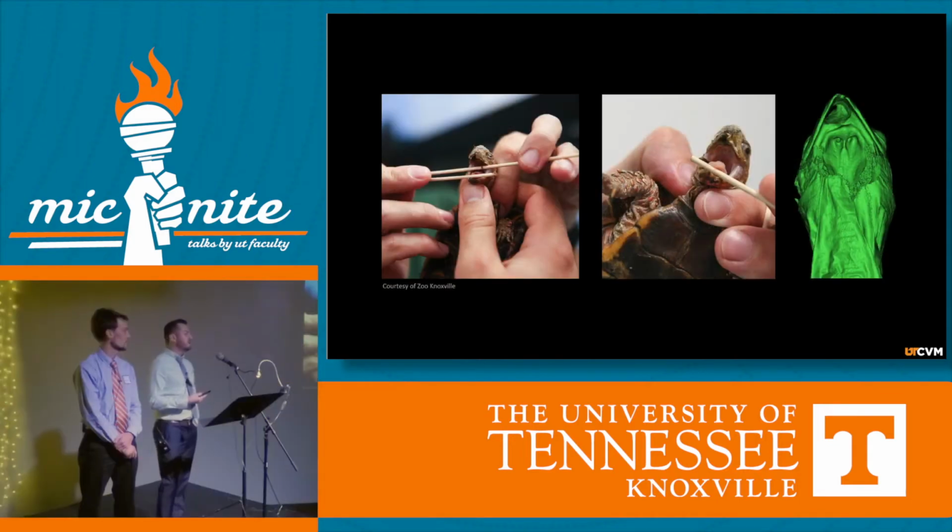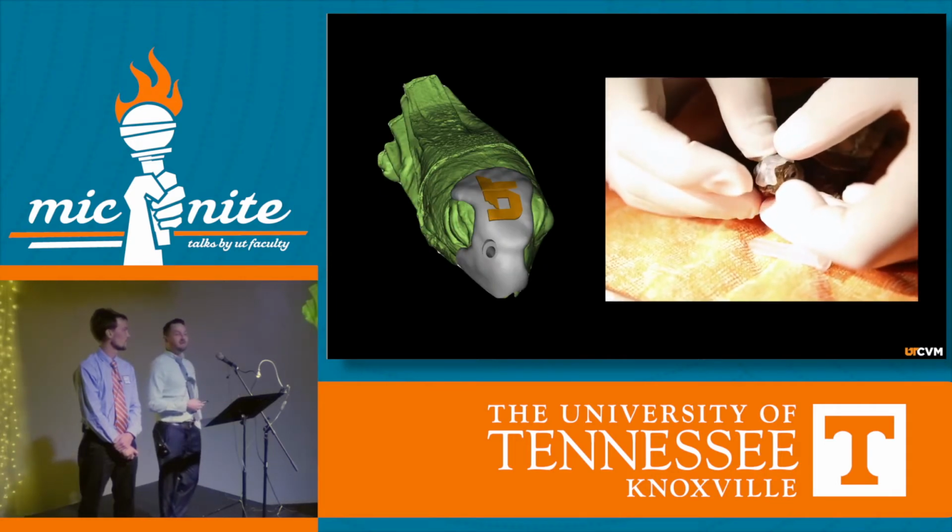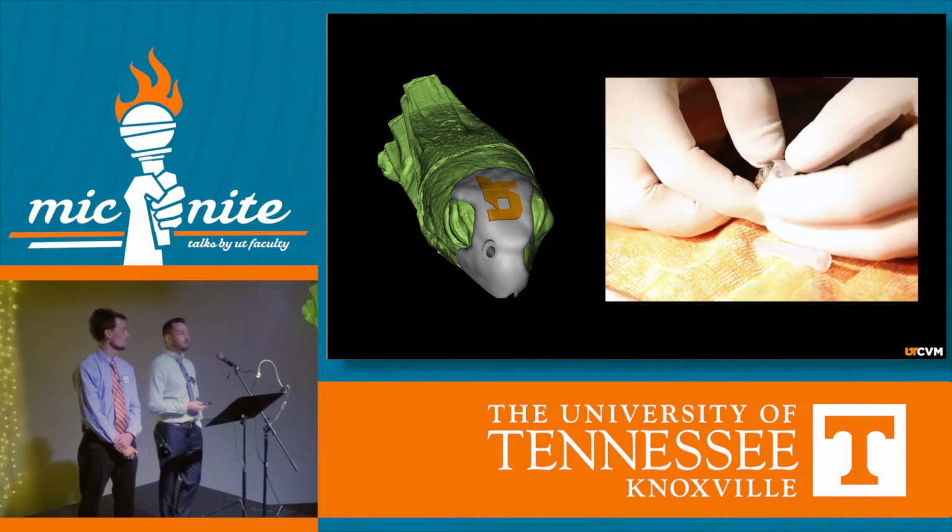But the problem is he kept getting the roof of his mouth impacted with food. So while we stopped dirt from the outside, we didn't do anything for food going up in the middle, on the inside. But really, he doesn't have a hard palate anymore. So by the time this mask fell off, we'd already come up with a new design that hopefully would solve both problems. And the way we tried to do that was actually borrowing a little bit of information from dentists, and we wanted to actually make him a tooth where his hard palate used to be.